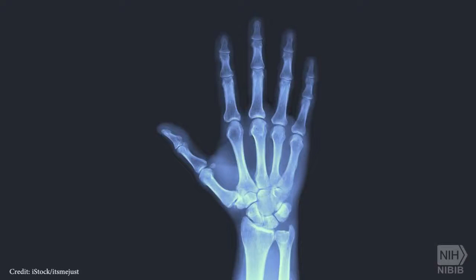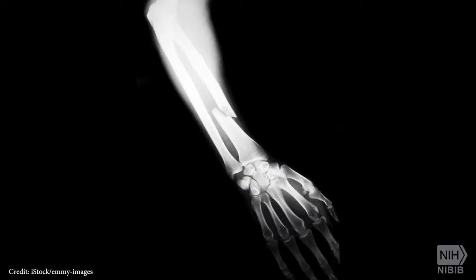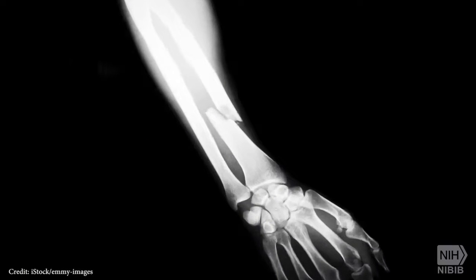film or on a digital sensor, so that bones are clearly visible while soft tissues, such as muscle, are shadowy. As a result, the two-dimensional images formed by the X-rays are quite useful in revealing structures within the body and can easily display fractures in bones.